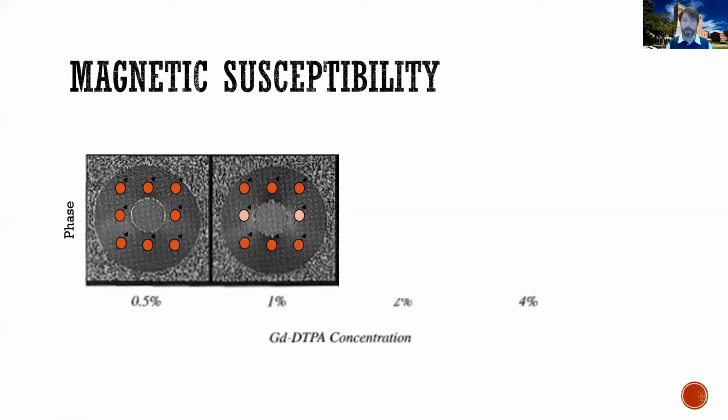As a result, their Larmor frequency will be different, maybe a little faster, maybe a little slower. So now we have 6 protons all going at the same Larmor frequency and 2 going at a different frequency. So compared to before, compared to this state where we had very little gadolinium, do you think these protons, if at TE, so again, we put in the radio frequency pulse, we stop the radio frequency pulse, we wait 20 milliseconds, so we wait for protons to swing for 20 milliseconds.